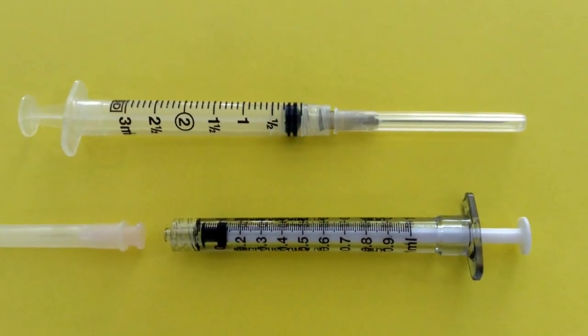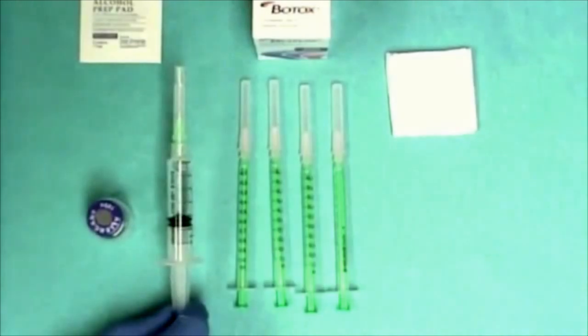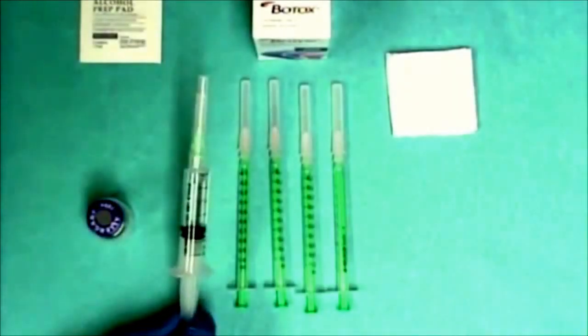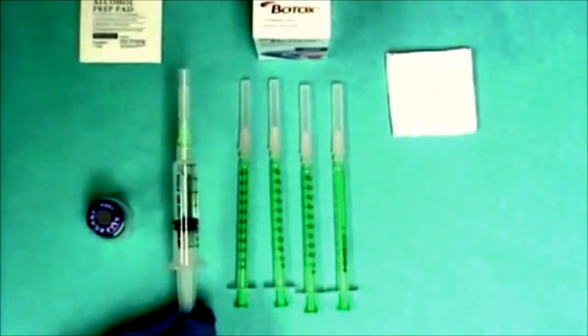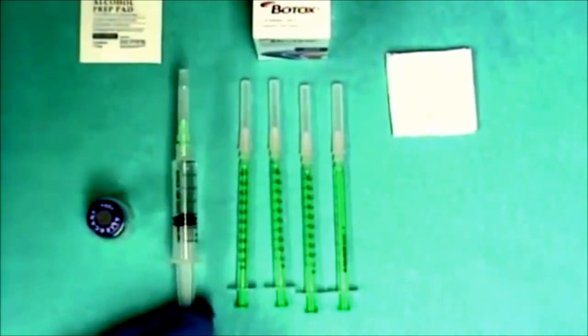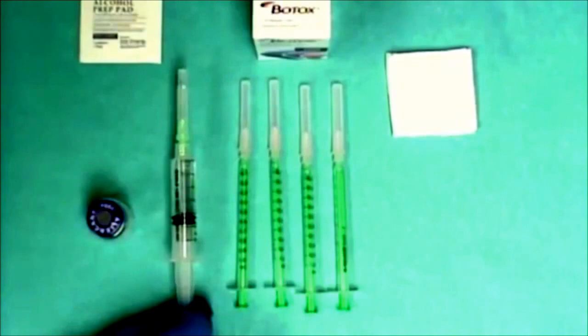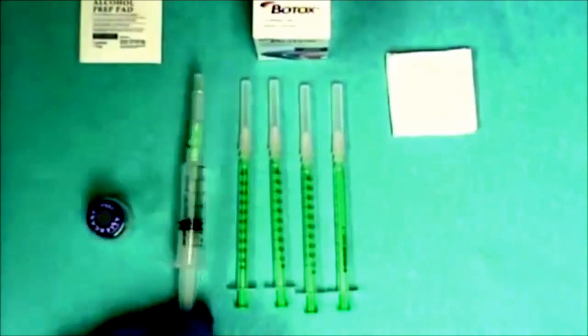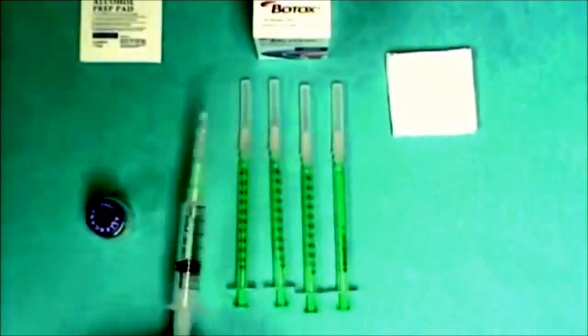Also this is the luer lock attachment, which is the standard twist lock between syringe and needle. So with your 3 or 5 cc syringe you aspirate 2.5 cc of saline, which is the standard recommended manufacturer volume to reconstitute a 100 units vial of Botox.